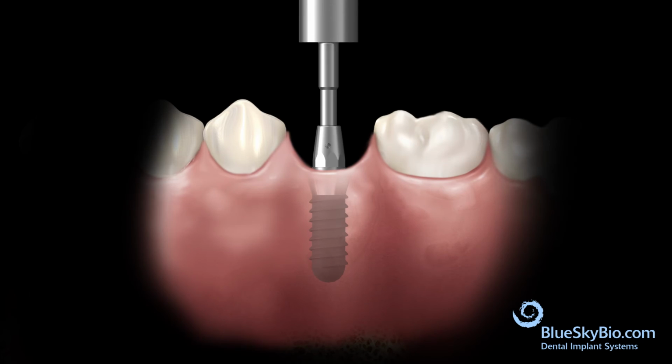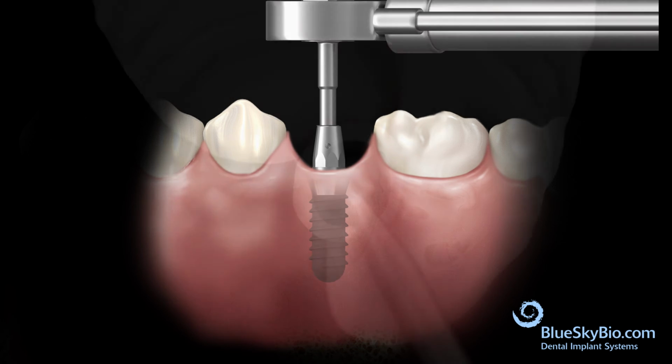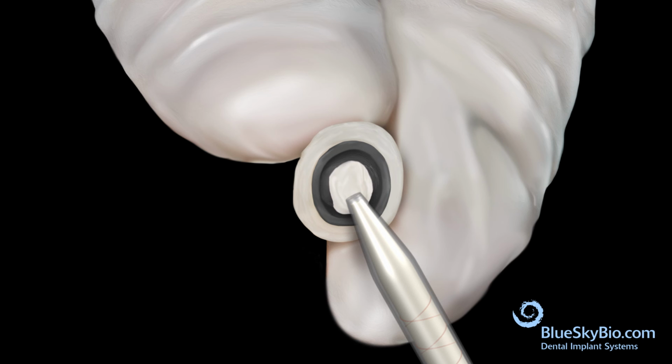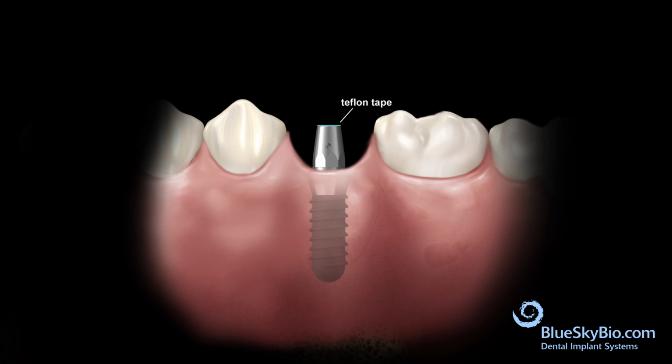Insert the abutment into the implant in the position marked by the technician. Use the torque ratchet to tighten to 30 Newton-centimeters. Apply cement to the crown. Block out screw access hole with Teflon tape. Place the crown into the mouth and remove any excess cement.